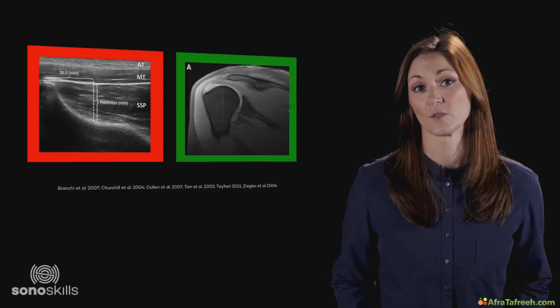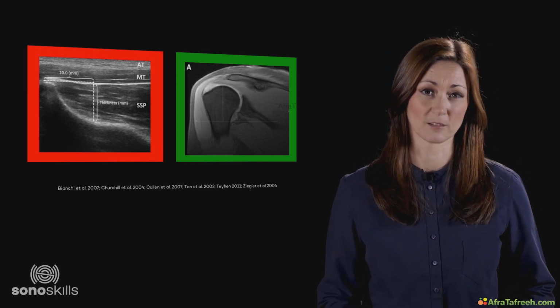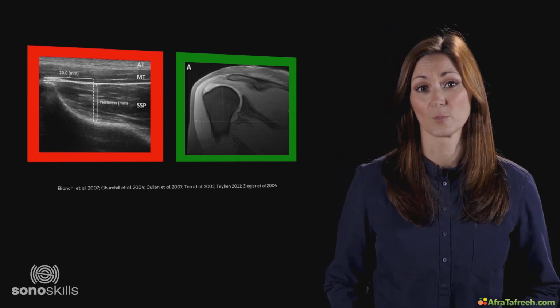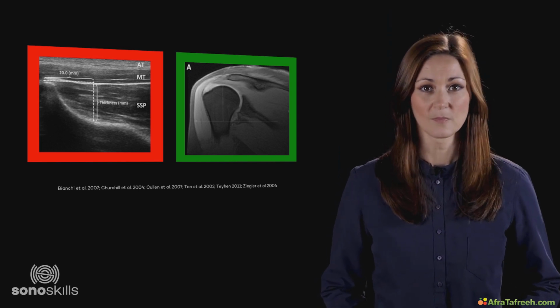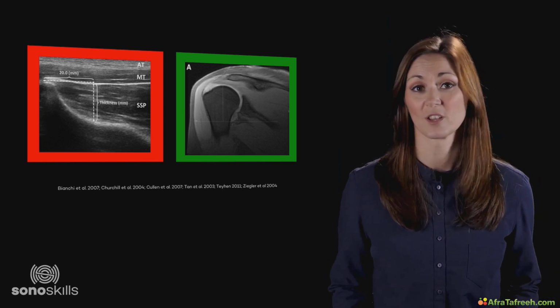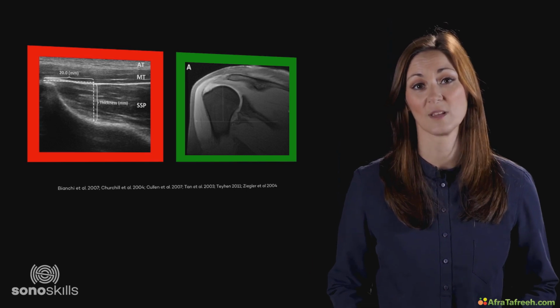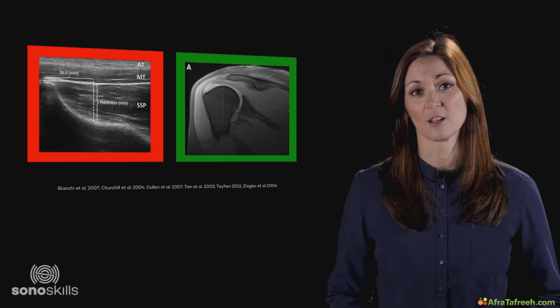The only disadvantage of ultrasound compared to MRI is that ultrasound is highly experience dependent. So ultrasound is difficult to standardise. It has many possible equipment settings and requires lots of experience and practice. Please realise that ultrasound is not profession dependent. All musculoskeletal healthcare professionals can learn musculoskeletal ultrasound as long as they meet certain criteria. These criteria will be explained in another presentation.